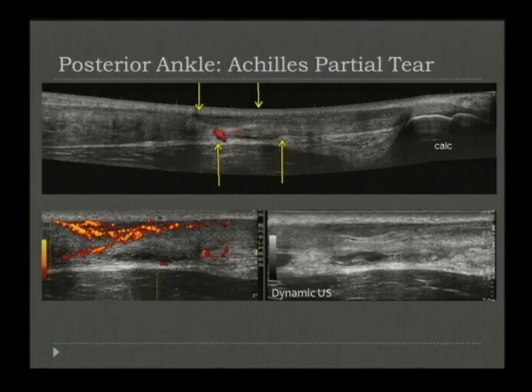Well, here we saw that in that hypovascular critical zone, we saw this area of granulation tissue and inflammatory changes, and thought that there potentially could be a small area that was contiguous, but we're uncertain whether these are two opposing pieces of the tendon or if there was actually a small amount of the tendon intact. And again, this is where dynamic imaging prevails.